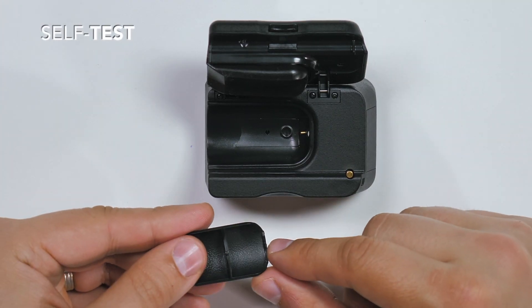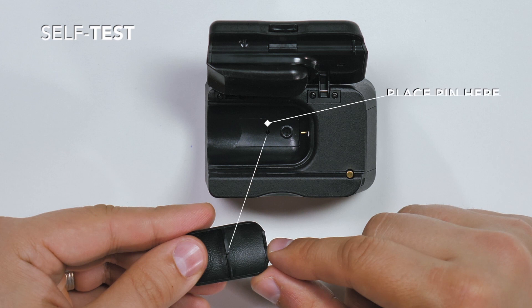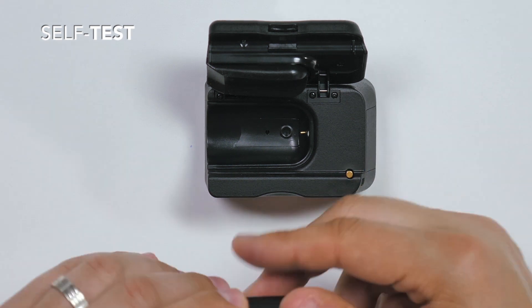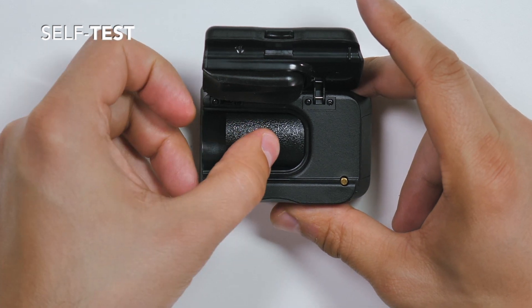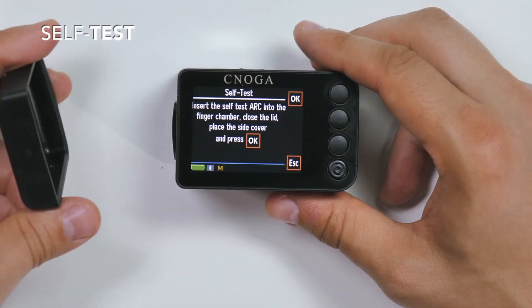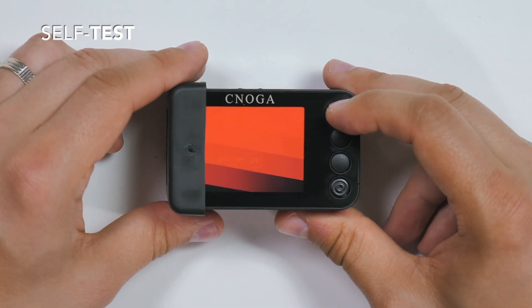Now insert the plastic arc into the finger chamber. The small pin at the bottom of the arc needs to be placed inside the hole at the bottom of the chamber. Put the device into the rubber cover and press OK.